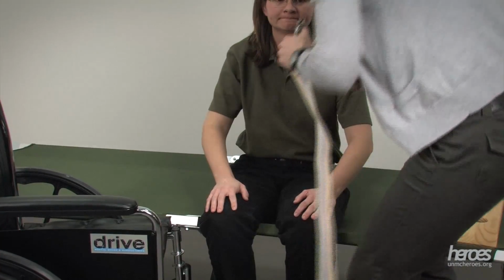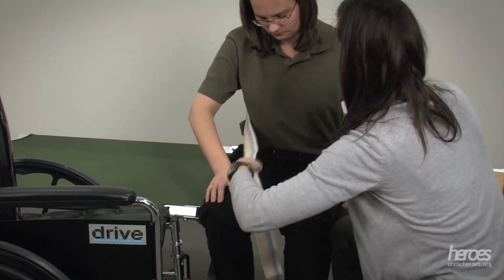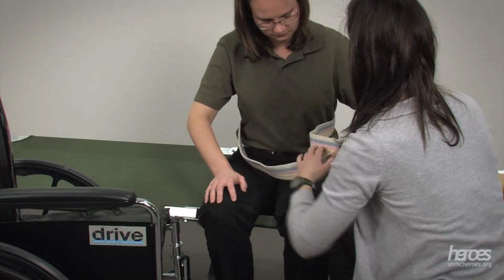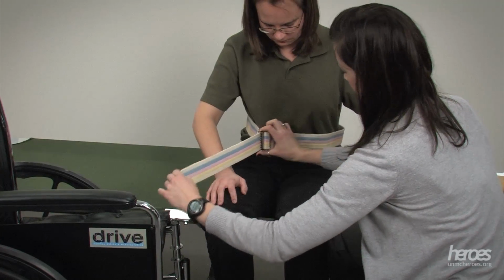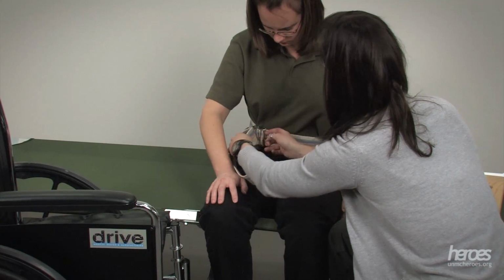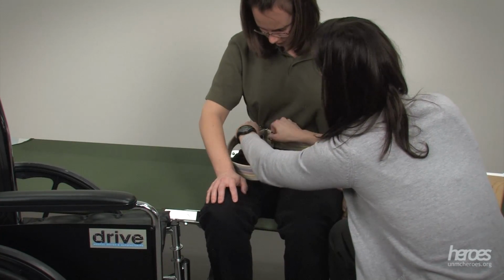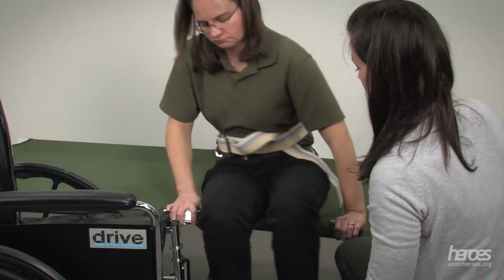Fasten a gait belt around the individual's waist for safety. Thread the head of the belt through the teeth of the buckle first, then through the other end. Make sure the belt is nice and snug. Ask the individual to scoot forward on the cot.